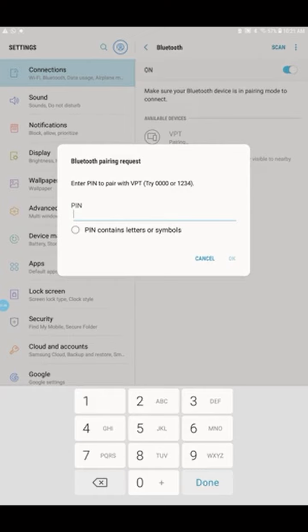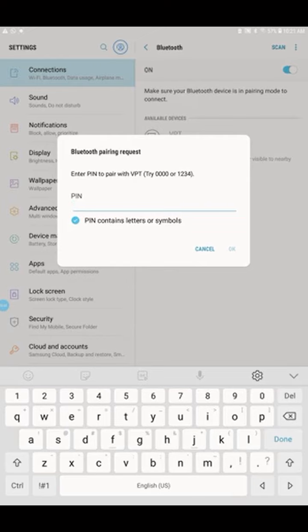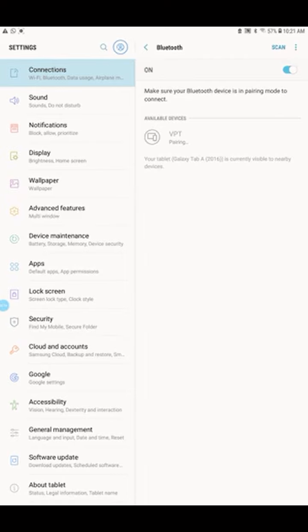Okay, but the password is showing only numerals, but our password is VPT1, VPT all capital, but I cannot enter. So if you see just below the password, you have a button, pin contains letters and symbols, so I am selecting it. Now you can see at the bottom, the screen changed to alphanumeric. So I select V, capital P, okay, VPT and then 1. Okay, so I am pairing it. It says pairing. Now you can see paired devices. Under that you have the VPT. Now VPT is paired. That means the vibrometer is connected to the mobile or the tab.